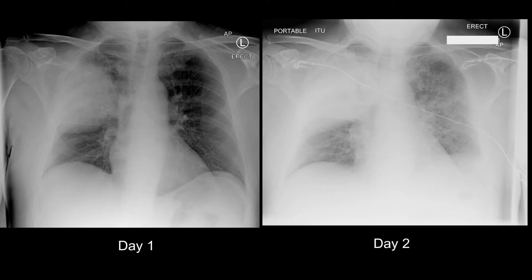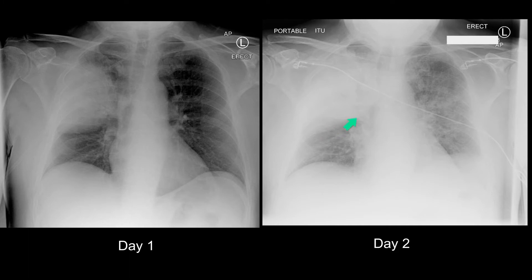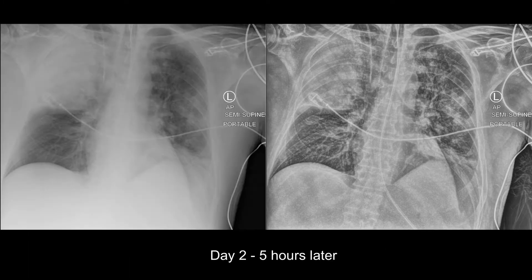Day two, things get worse. The opacification is more intense, although this could be due to the exposure factors. The air bronchogram is barely visible, and there is an impression that whatever is going on in the right upper lobe is expanding. Later on day two, a further chest radiograph shows another inferior convex border to this fissure.